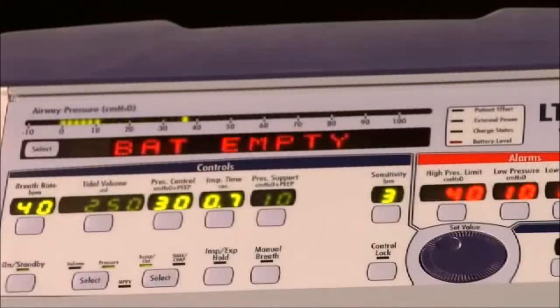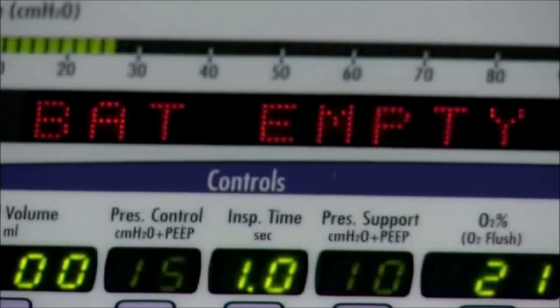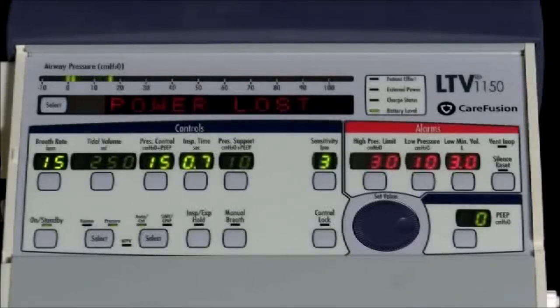When a battery empty alarm occurs, the battery level LED is red. The battery empty message is displayed and the audible alarm is sounded. When the battery reaches the empty level, the ventilator will run for approximately five minutes at nominal settings. To temporarily silence the battery empty alarm, press the silence/reset button. The power low alarm occurs when the ventilator is operating on external battery power and the voltage drops to the low level. The power low message is flashed in the display window, the external power LED is yellow, and the audible alarm is sounded. To reset the power low alarm, press the silence/reset button twice.